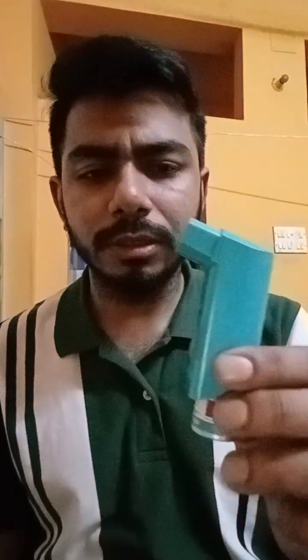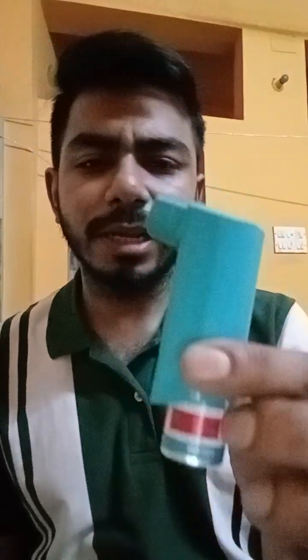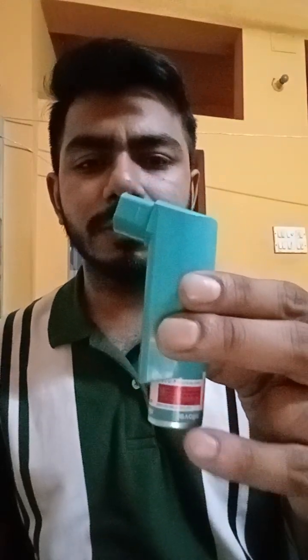So today in this particular session I will be talking about how we should take the inhaler in the right manner. So this is the inhaler, right? The drug can be anything. It can be an anticholinergic, it can be a beta 2 agonist as well, like levosalbutamol. But the thing is how to deliver it. Here you can see the number of doses. This is showing 0, which means it does not have any dose left. This is just for demonstration purposes. So that's how the inhaler looks, and that's the medicine.